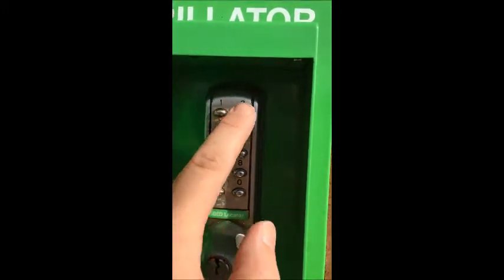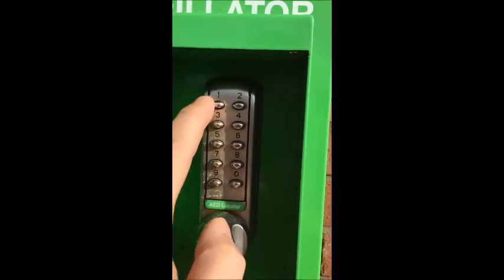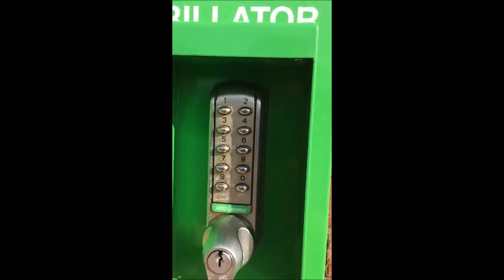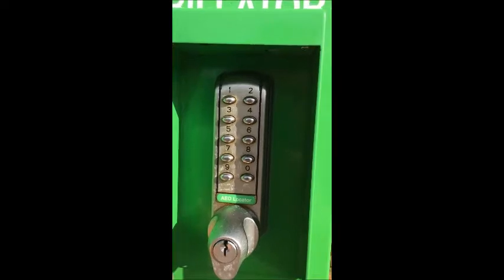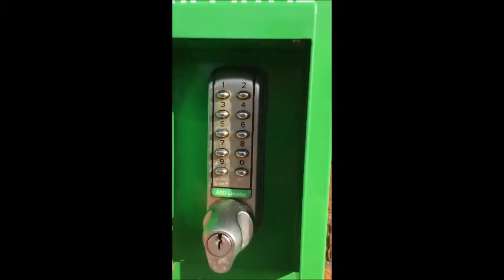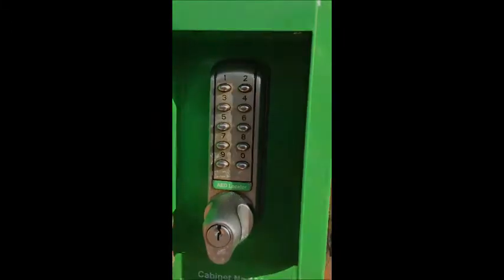We're going to be looking up here at these two little LED lights. There's a blue light which indicates that the code has been entered correctly, and then there's a red light which would indicate a bad code. If it flashes before the blue, that indicates that the batteries in the lock need to be changed, and I'll show you where that is in a minute.